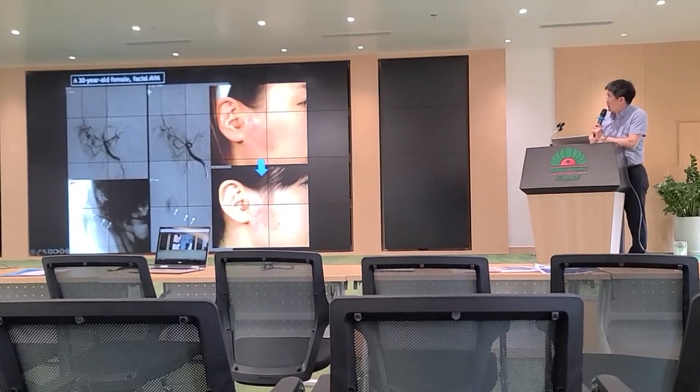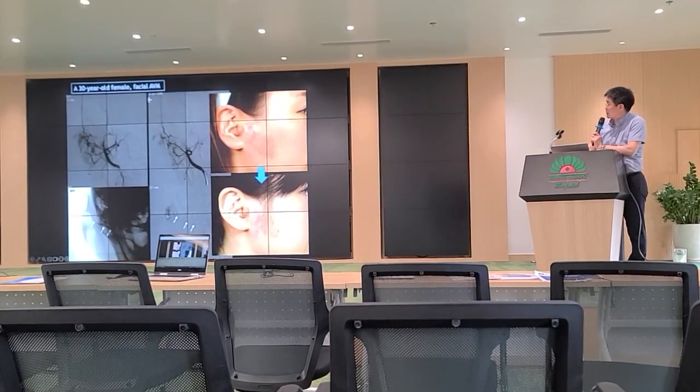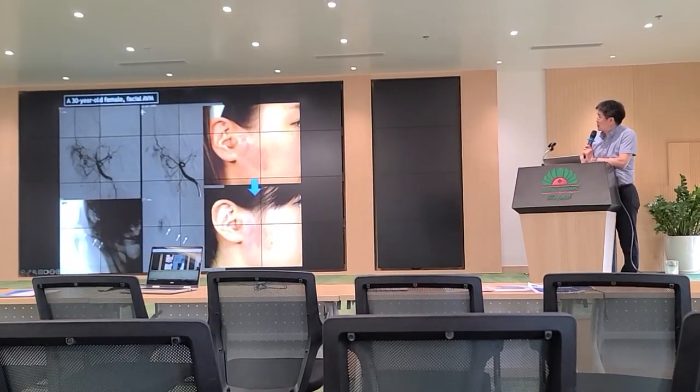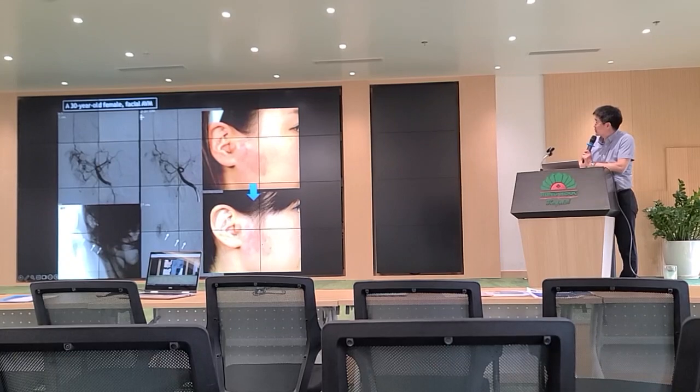This is the microballoon catheter, and we used the microballoon catheter, and in just one session, the lesion was partially improved.